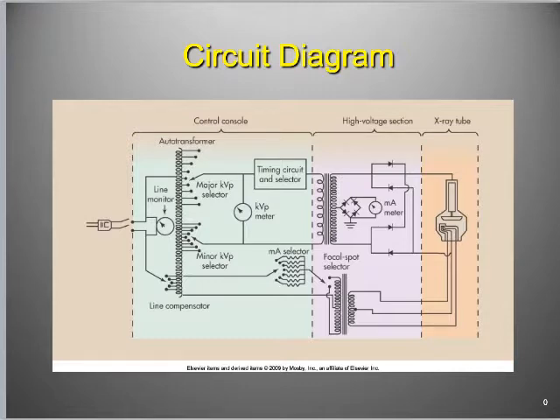It's not reading actual kilovoltage peak. It's saying what it would be once we apply that to the step-up transformer. So it's reading it on the low voltage side, pre-reading it and saying this is what that would translate to once it hits that step-up transformer. Okay? That's the KVP meter. It's a pre-reading meter.